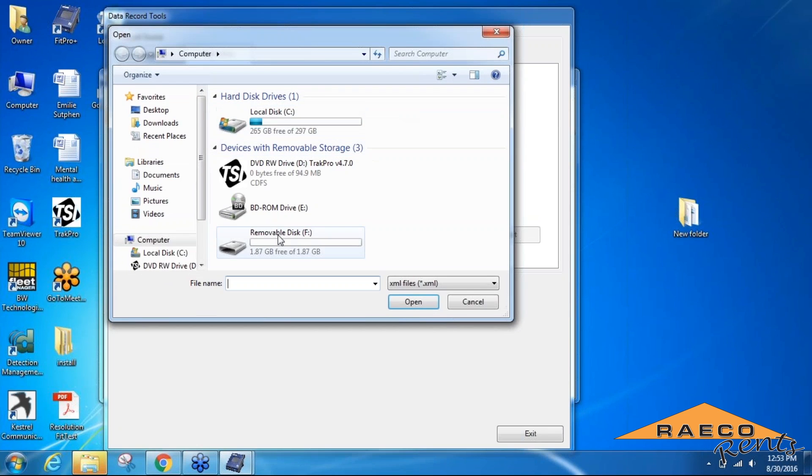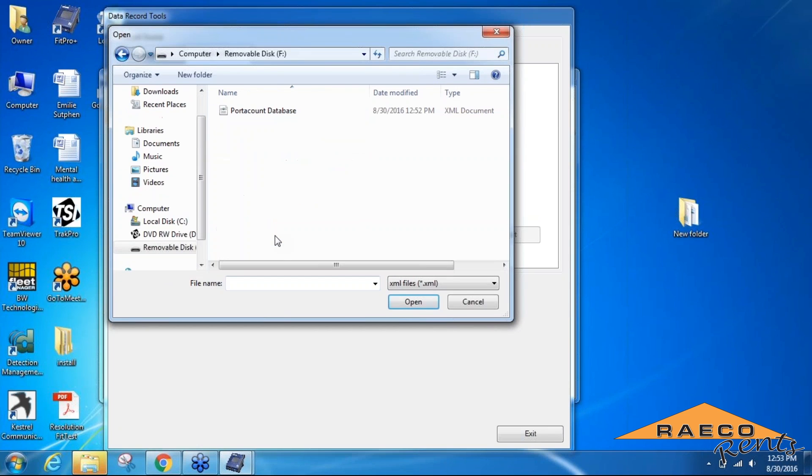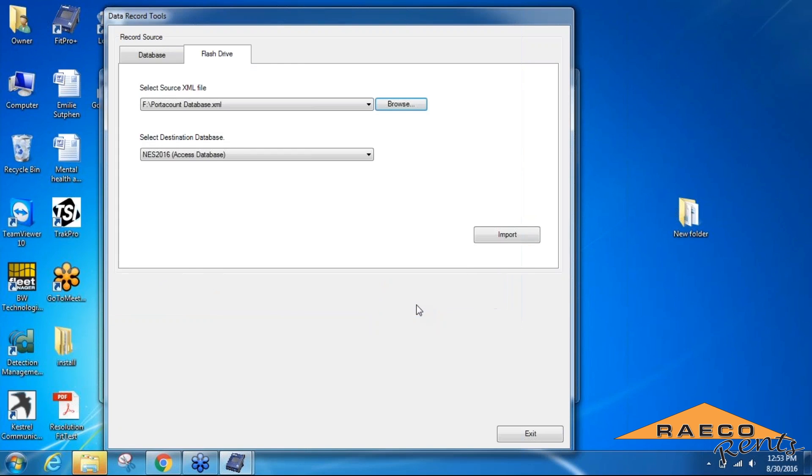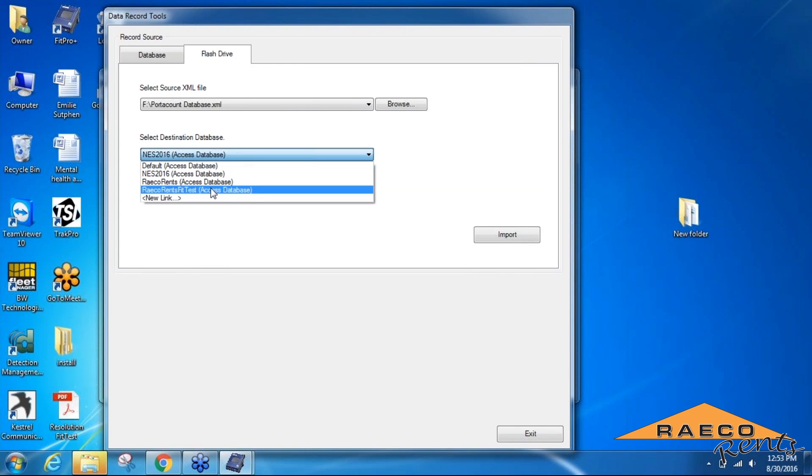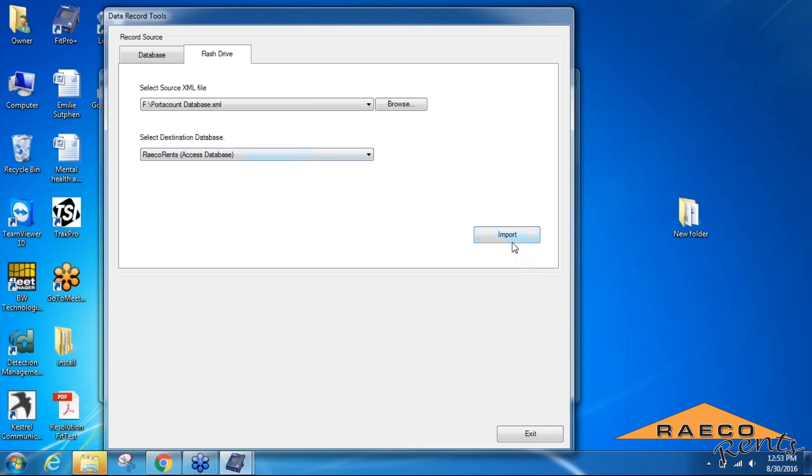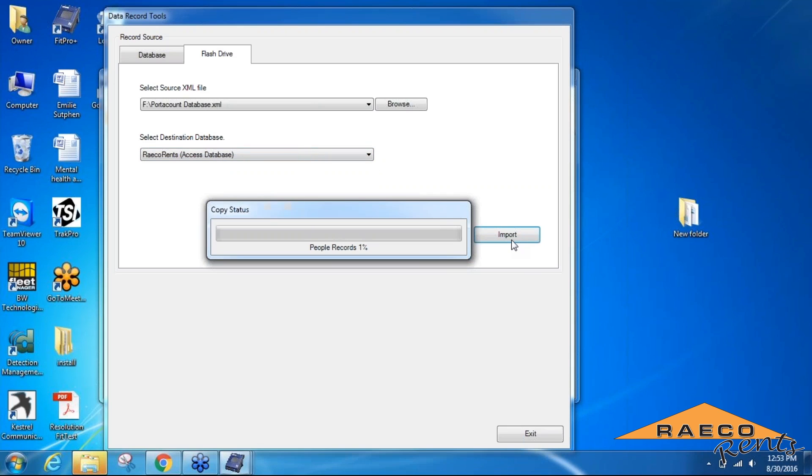Then the destination we can change to the database that we also created on the computer earlier. When we import that, everything should transfer from the flash drive to be saved locally on your computer.